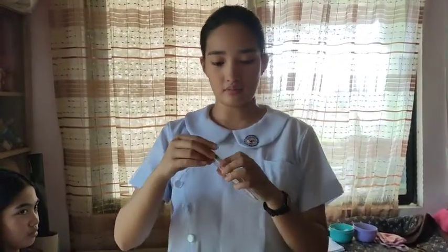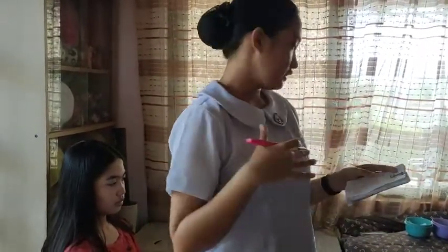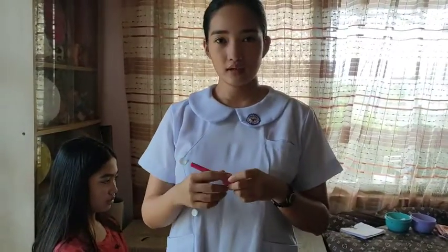After disinfecting, we return the thermometer to its storage location so we do not misplace it. Disinfecting the thermometer after use ensures the safety of the next patient and avoids contamination. We will now record 36.2 degrees Celsius on our notepad, because it is very important to document our findings in objective data — anything not documented is considered undone.